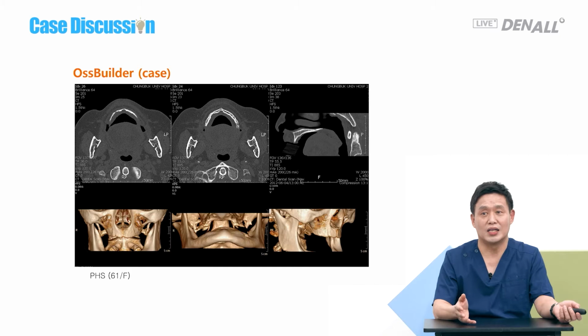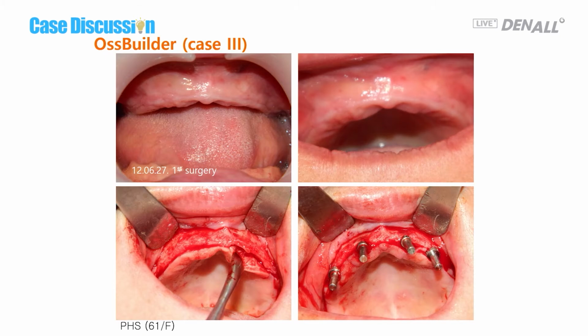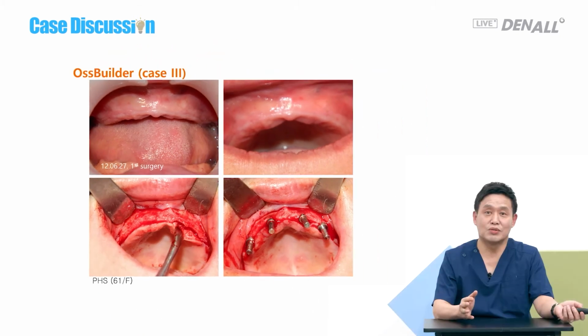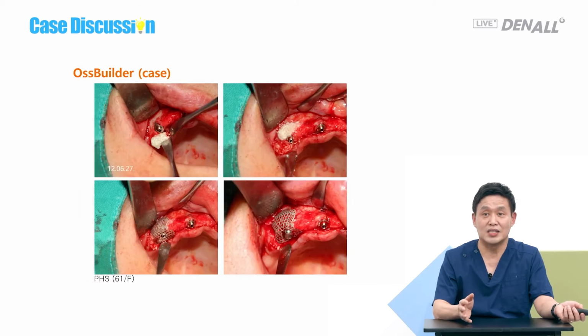She used the denture for 10 years, so the jaw bone got reduced and the tissue got movable. So we took the CT images, the medical CT, not cone beam CT. A lot of bone resorption on the maxilla because of denture. It wasn't really good to place implants. I opened it. Like the previous case, I told her that the fixed would be difficult and the 4 were placed and the fixtures were exposed, so bone graft was done.